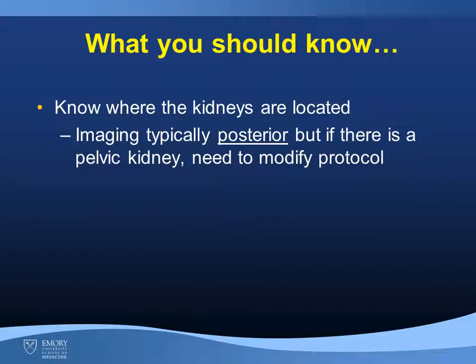You also want to know where the kidneys are located. This study is typically imaged posteriorly, but if there is a pelvic kidney, which is relatively anterior, one will need to modify the protocol to be able to image that kidney.